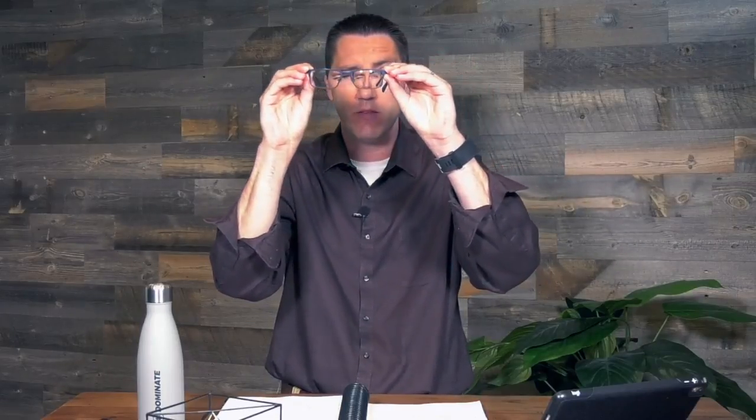Because what you do is you look at an object, right? Close one eye and then look at, guys, I'm looking at the camera, right? I'm watching, okay, is the camera moving with my motion of my lens or against the motion of my lens? And that'll tell you whether you have a myopic or a hyperopic prescription, right? So the key take-home message is to remember which one's which.